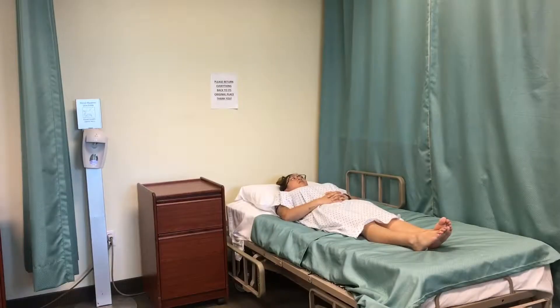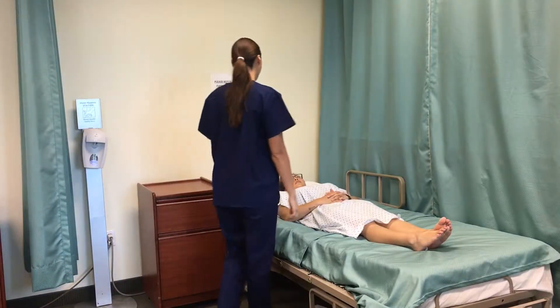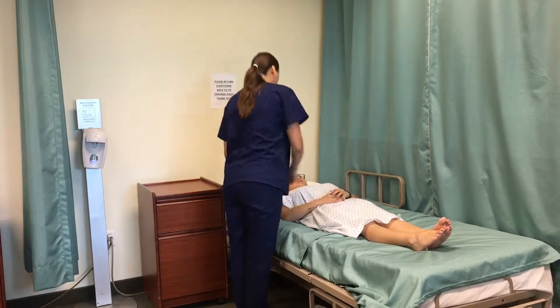Introduce yourself to client and explain procedure. Hi, Mrs. Smith. My name is Denise. I'm going to be your CNA today. We are going to have you get up and measure your weight. Is that okay? Yes. Can I have your birthday, please? Okay, great.